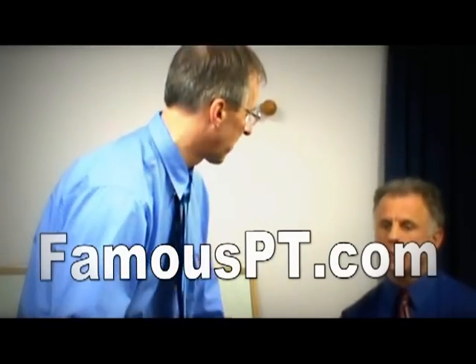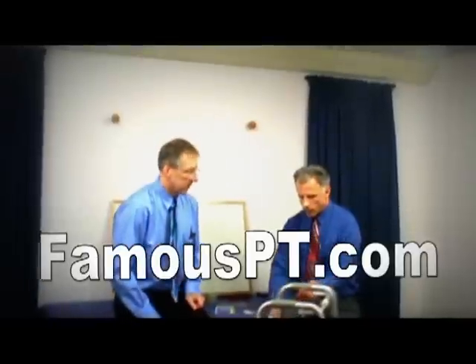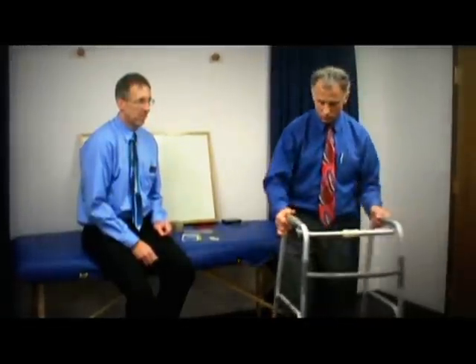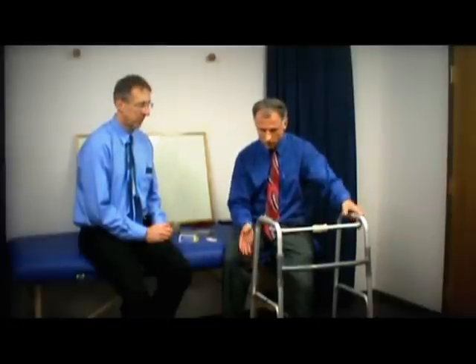Brad, what are the disadvantages of those skis? Well, they're still noisy. When you slide the rubber across a hard floor, like linoleum, it will chatter and grip and scratch the floor. The ski will do the same thing, especially if you take it outside and it gets a little dirt impregnated in it, then you've got scratches going down your floor and it still makes the noise. The ski gets roughened up outside too, with grooves in it. They're really good for outside, but not the combination. So if you have a walker for inside only, the skis aren't the best. You want something that's going to be quiet.